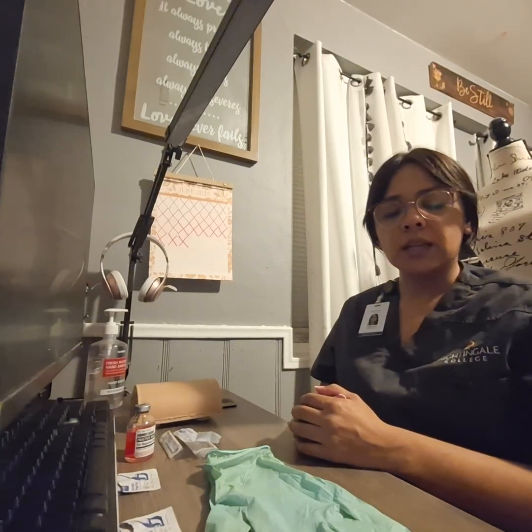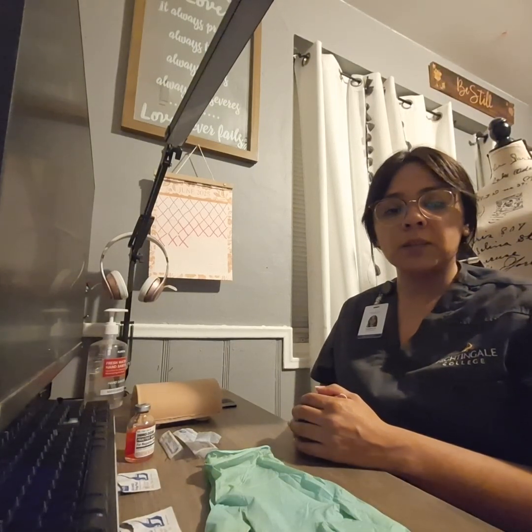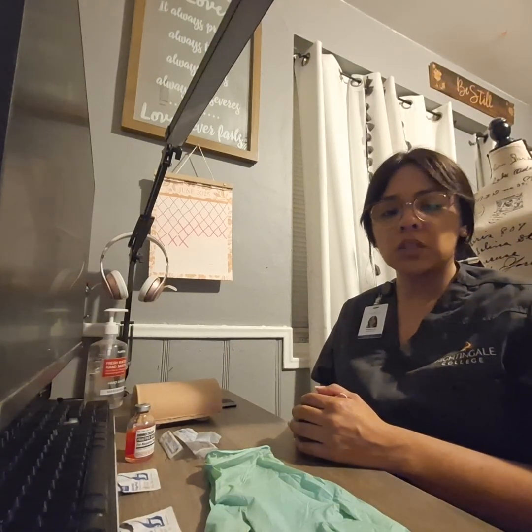Hello, my name is Stephanie and today I will be performing the subcutaneous injection skills video.